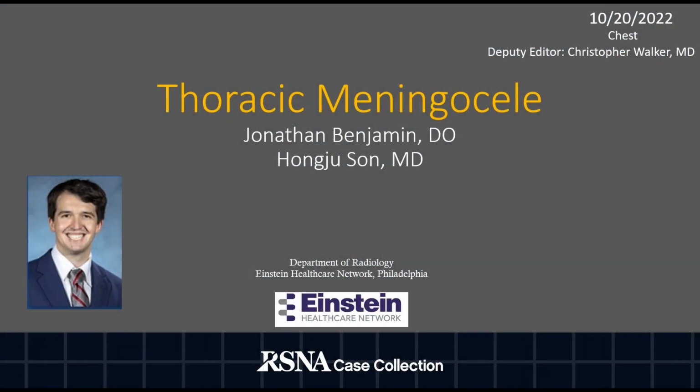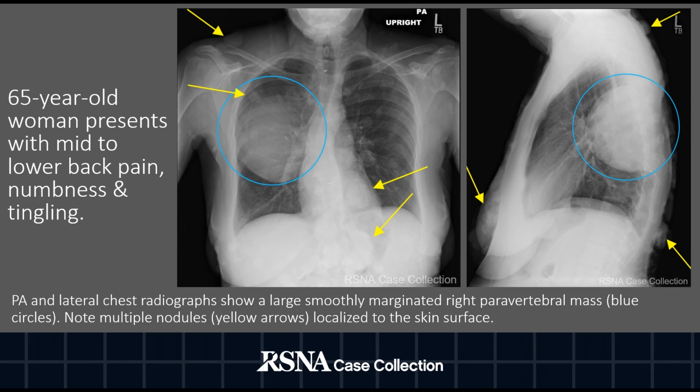My name is Jonathan Benjamin, and I am a second-year radiology resident at Einstein Medical Center in Philadelphia, Pennsylvania, and I'll be presenting my case on a thoracic meningocele. Our patient is a 65-year-old woman who presents with mid to lower back pain, numbness, and tingling.